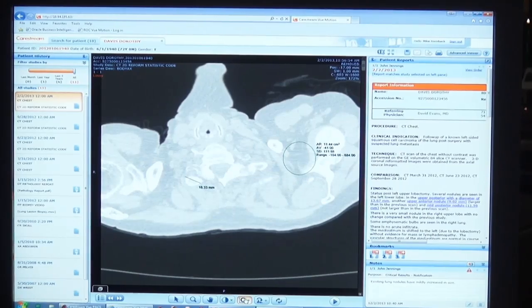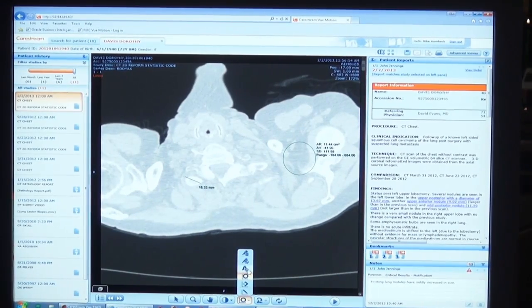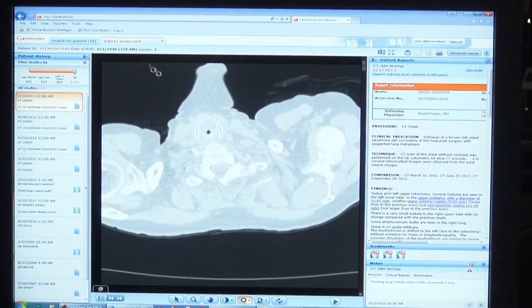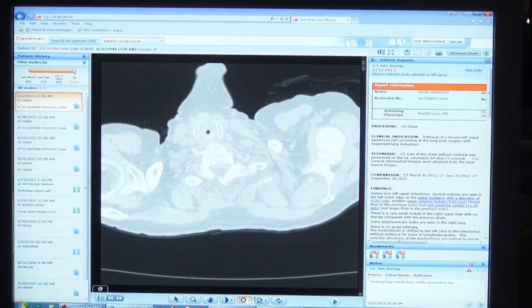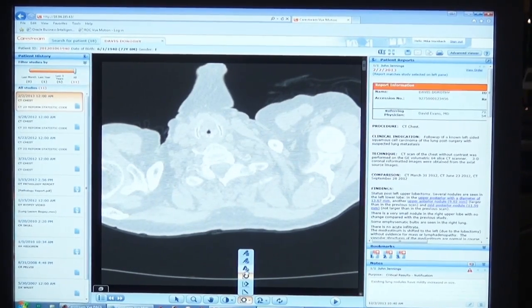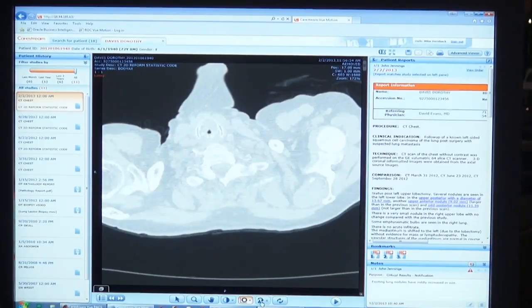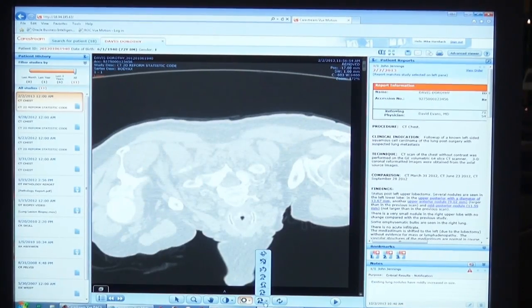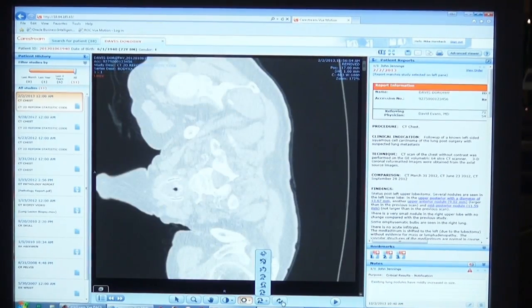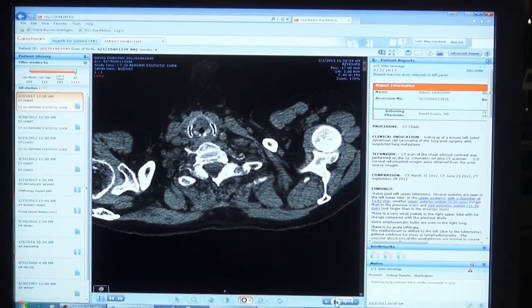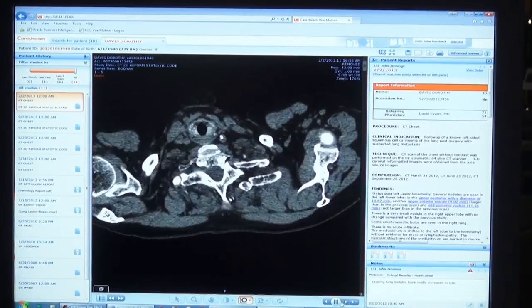These measurements can be hidden or deleted. The series can also be anonymized by hiding the DICOM tags. I can flip studies, rotate, reset the studies, or play in cine mode.